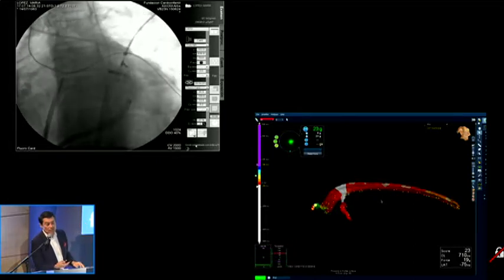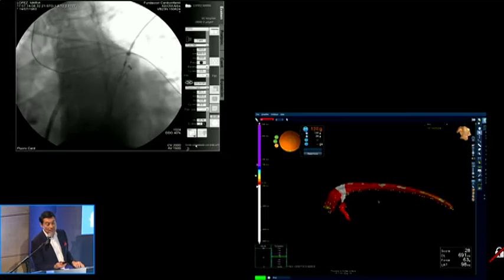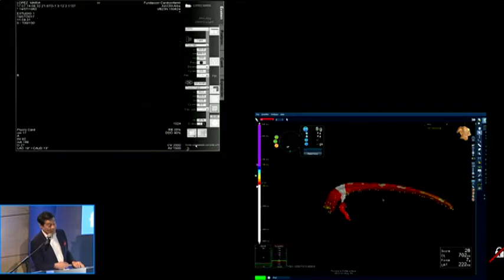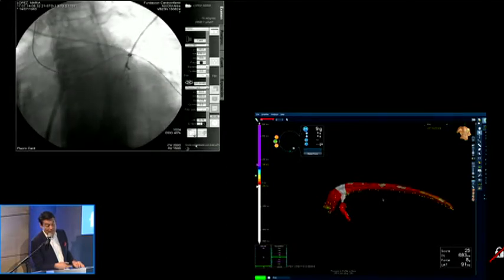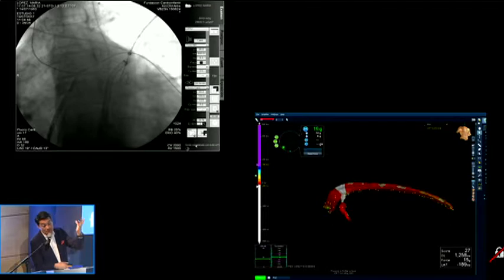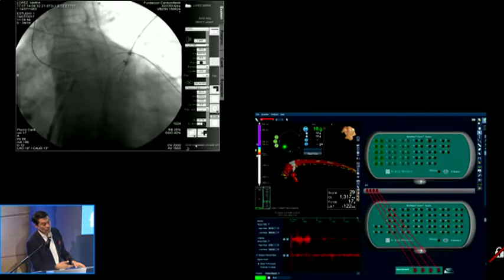And remember that there was a recent paper published with a report of the fact that almost 40% of ablations in the left ventricle for arrhythmias, which were idiopathic initially, were correlated with small lesions in MRI of an embolic appearance. So what we are proposing is to map more, to do more entrainment, more pacing with multi-electrode guide in order to be more specific, and as we are more specific, be able to be more aggressive.